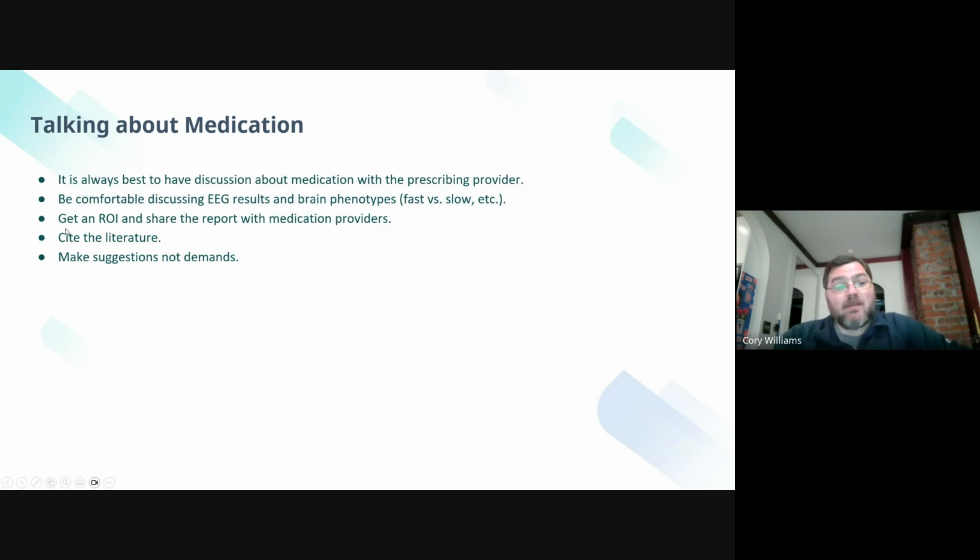I highly recommend that you get an ROI and share your EEG reports with everybody on the team, including medication providers. That way everybody's in the loop. And also it gives you a chance to talk to people outside of your practice about EEG and EEG reports and the power that you wield, right? It's a really cool thing to be able to do an EEG for someone, and you want to be able to share that with everybody else on the team. So we try to get an ROI for medication providers, but also therapists, outside counselors, family doctors, pediatricians. We want to make sure everybody on the team gets a copy of the report.